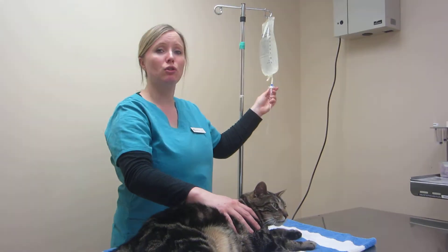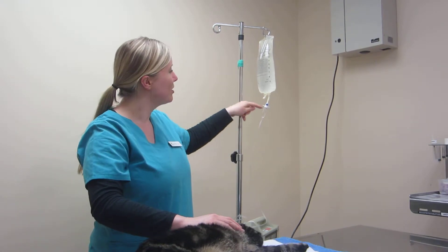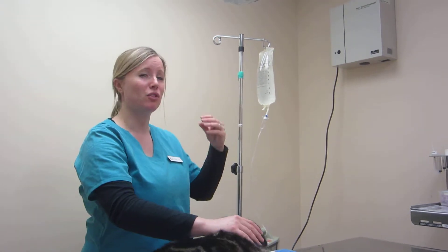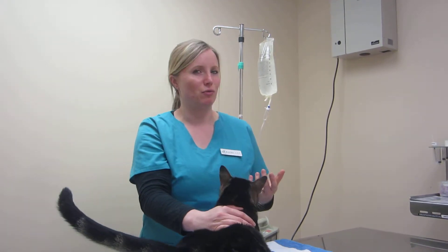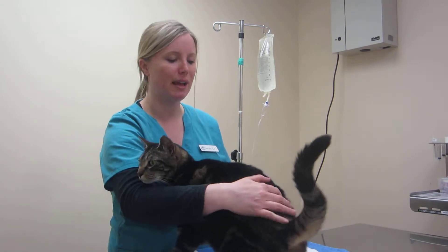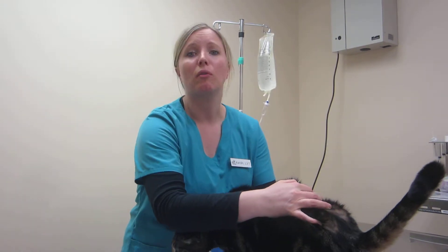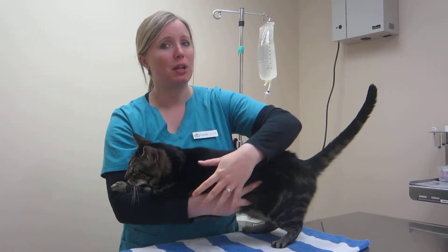You're going to look at your drip chamber, which is going to tell you, okay, yeah, we're in business. You should have a nice steady flow. If it's drip... drip... drip... really slow, you know something is wrong. Then you want to maybe redirect your needle a little bit and it should go a little faster, or just start over. Those are the two most common things that happen.